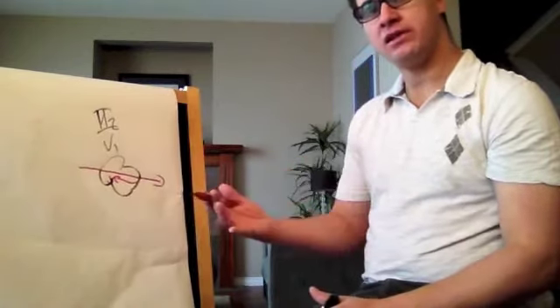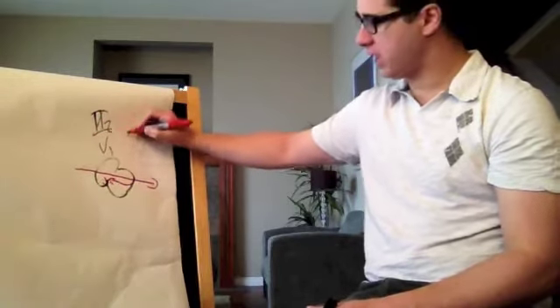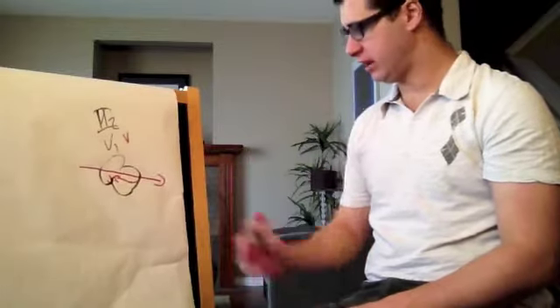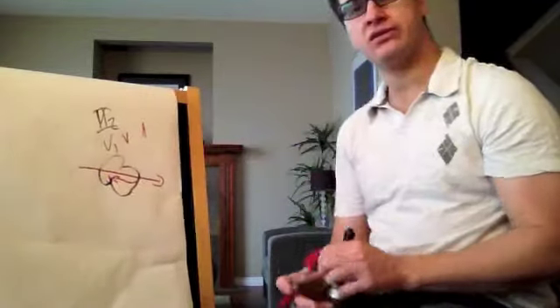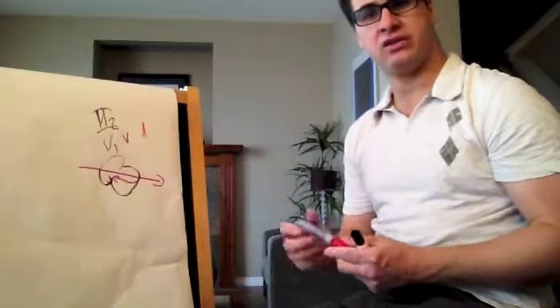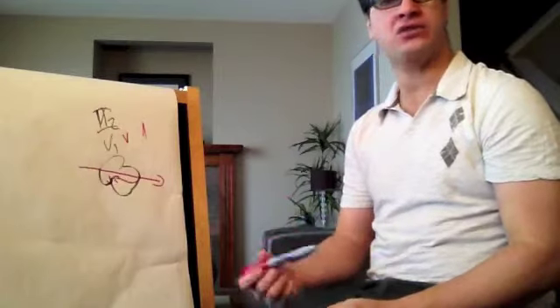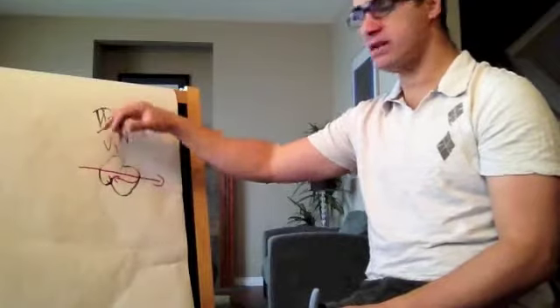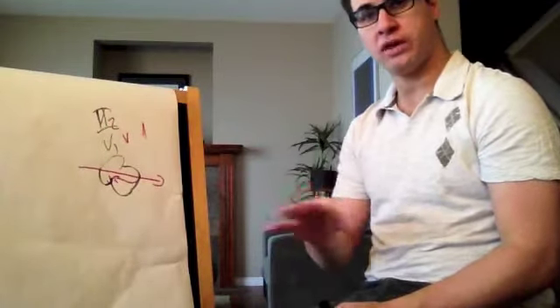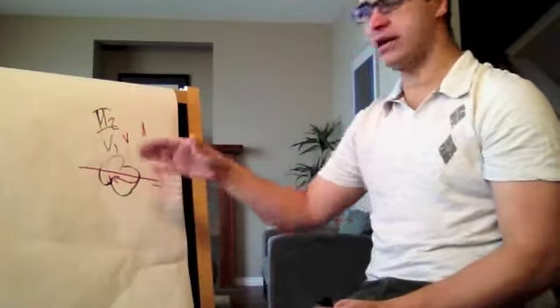It will be positive. Because usually, because the electricity is going this way, everything should be mostly on the negative side. But if it comes from the ventricle, that means now the electricity is going towards me, not away from me. It will be mostly positive. So that's why we put lead V1. It's mostly to catch VTACs or PVCs or any other rhythms that would come from the ventricle and come towards you. So if you keep those two leads, you're pretty much sure of catching 95% of the bad stuff coming and monitor the good things.